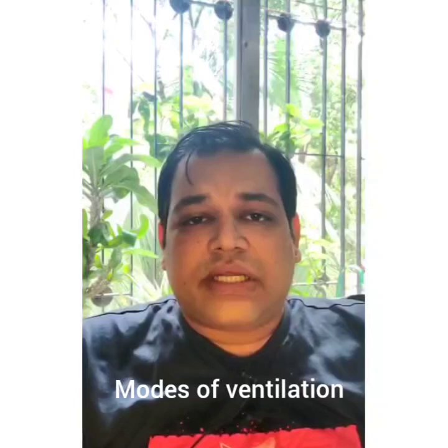Now we will discuss the different modes of invasive ventilation. Historically, the most ventilator dependent mode is CMV, or controlled mandatory ventilation. Below that, a less ventilator dependent mode would be assist control. Even below that would be intermittent mandatory ventilation, or even less ventilator dependent would be SIMV, synchronous intermittent mandatory ventilation. And if you go further down the line, there is pressure support. We will discuss these various modes in short detail, in principle, and go forward.